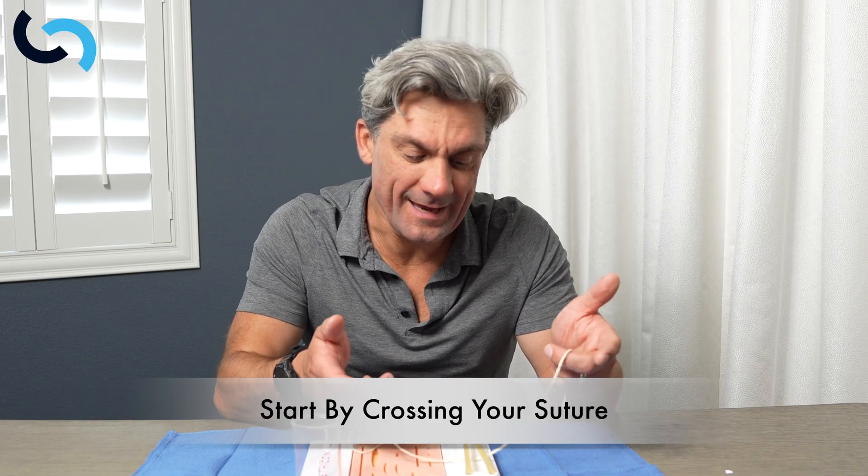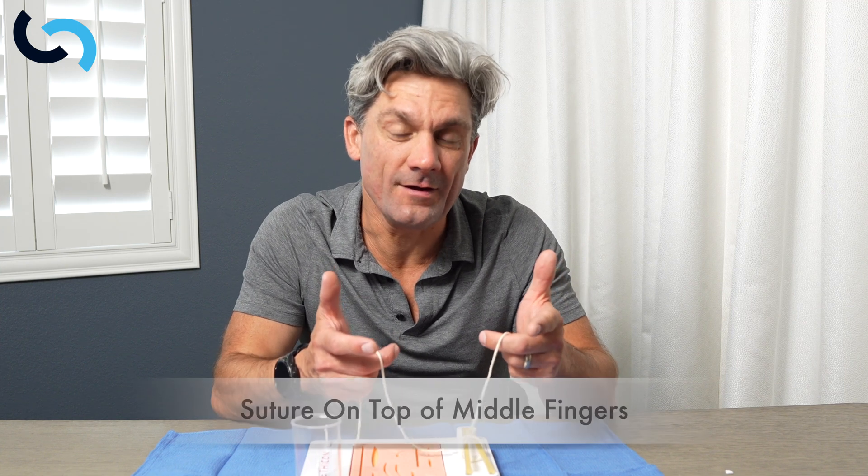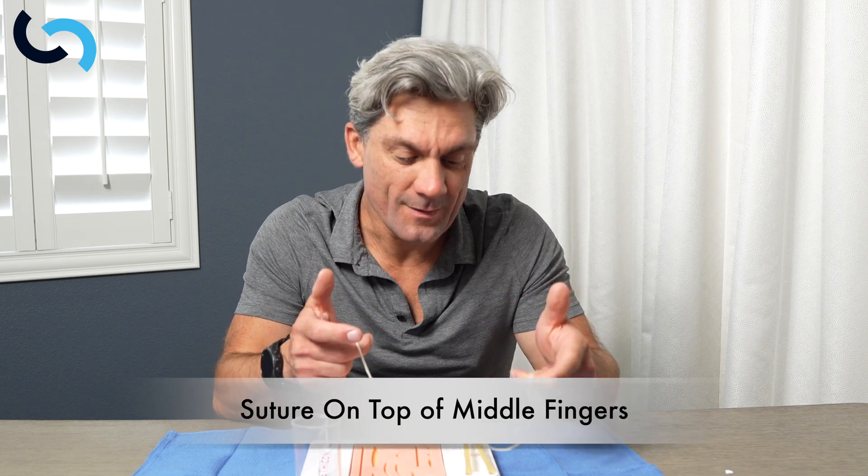Always when we think about tying, we wanna lay down square knots. It's almost impossible to lay down a square knot if you start with your suture uncrossed. So we wanna start by crossing our suture — I'm gonna take the right-handed suture and put it in front of the left-handed suture. Then I'll re-grab the suture right on top of my middle fingers, keeping my thumb and index finger free. The two knots are going to be the thumb knot and the index finger knot, and the first one is the thumb, which is gonna lay this knot down square.